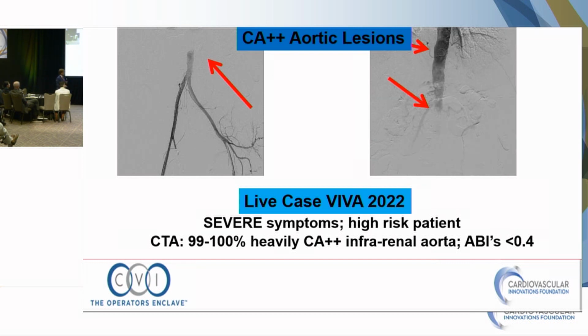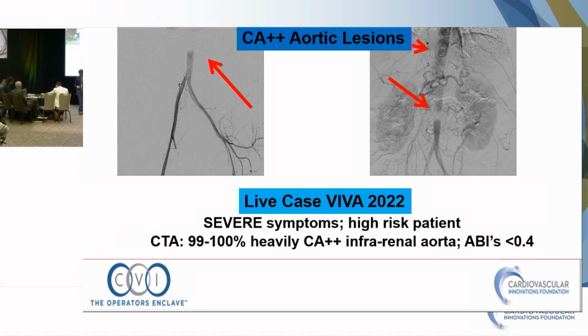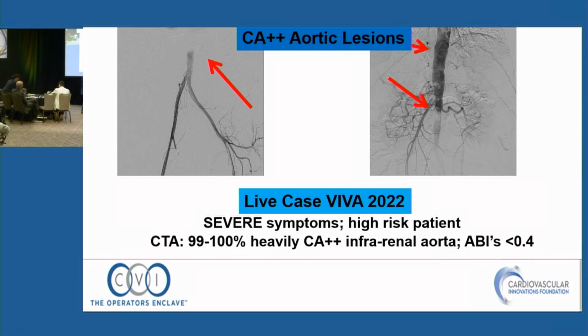Okay. I guess let me ask Dr. Eidt, since we're making it interactive, can you walk us through it surgically, or Ben, both of you can comment. We have 2 vascular surgeons here. To do this case, you have to clamp. Can you talk about the clamping and the renal arteries' proximity to the lesion, and how you would approach this surgically if you were going to do it, briefly, if you don't mind.